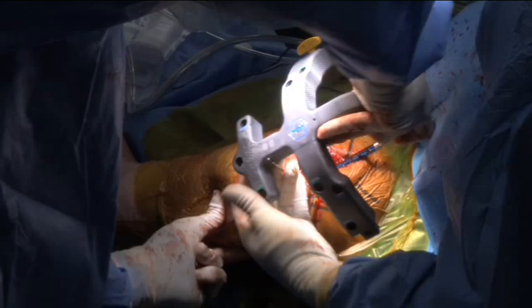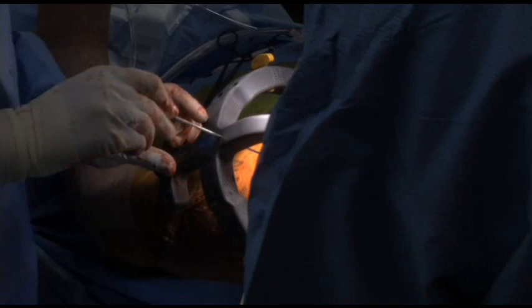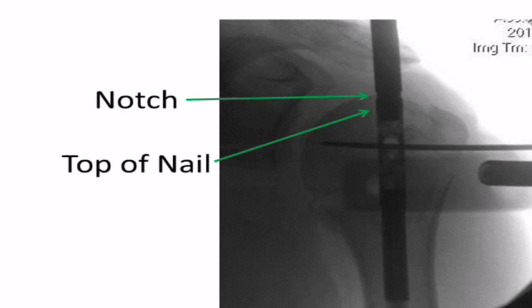The nail is then inserted. In this case, the greater tuberosity guide wire had to be repositioned and cut to facilitate placement of the nail and improve the reduction of the greater tuberosity. The pin can be placed through the jig to localize the top of the nail to help determine depth of nail insertion. An additional helpful marker of nail insertional depth is the small notch that is visible on the guide — if this notch is slightly proud by 1-2mm, or if it is at the level of the superior articular head, the nail is usually at the appropriate depth.